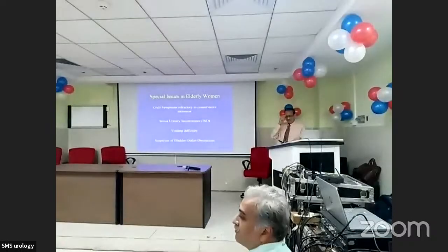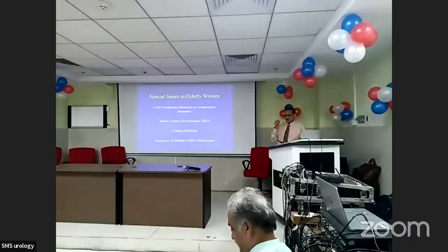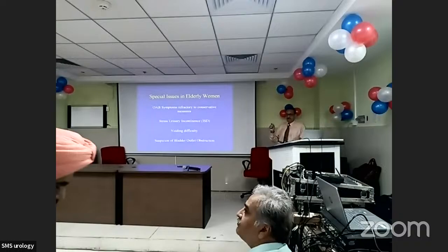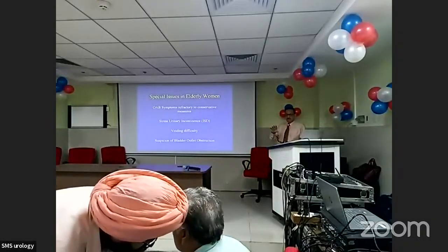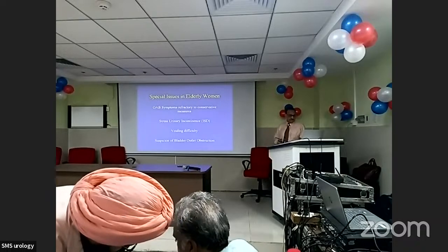One thing I want to emphasize here is that in an elderly frail woman, why do you want to subject her to urodynamics if you can manage it in a simple manner? Obviously, you can. But mind you, because their symptoms are mixed and there is a lot of overlay of various other comorbidities, I think it is important to distinguish one from the other, and therefore it's very important that we should have a careful urodynamic evaluation to find out the precise cause of the symptoms.